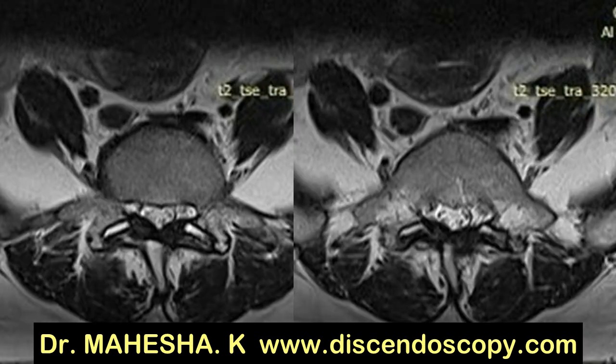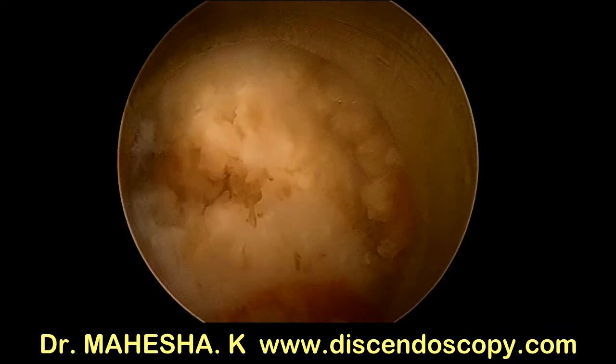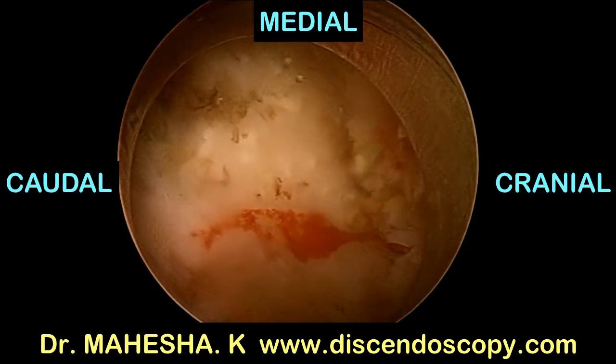This requires only a decompression and not stabilization and fusion. In this case a stenoscope was used. The level is marked, and the lamina, facet joint, and ligamentum flavum are exposed.